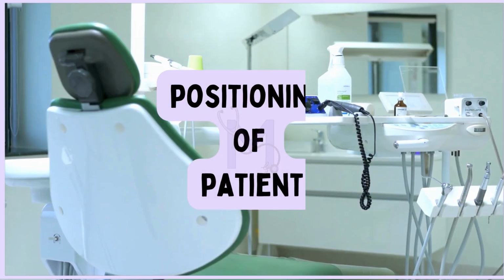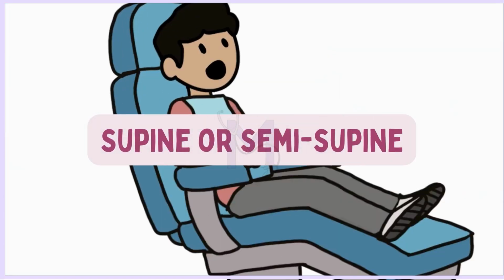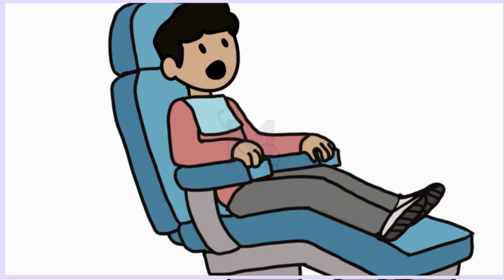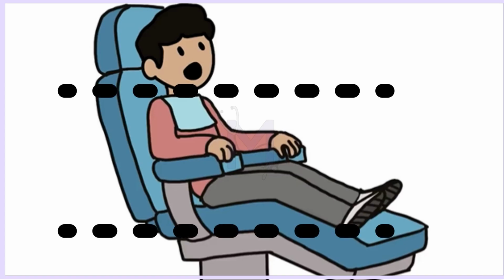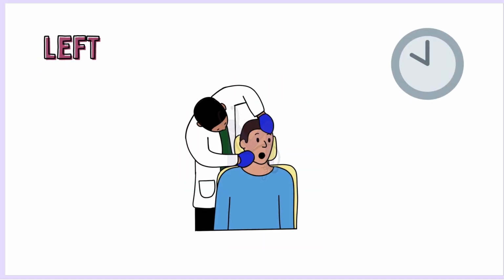When locating the landmarks in this technique, the patient must be in a supine position with the mouth wide open for visibility and accessibility, and the occlusal plane of the mandibular teeth must be parallel to the floor. In case of a right-sided block, the operator will stand at the 8 o'clock position facing the patient. For a left-sided block, the operator will stand at the 10 o'clock position by the side or slightly behind the patient.